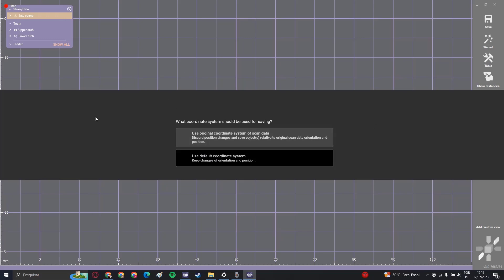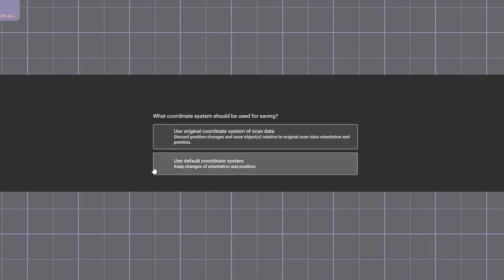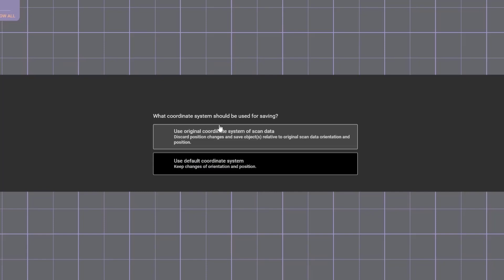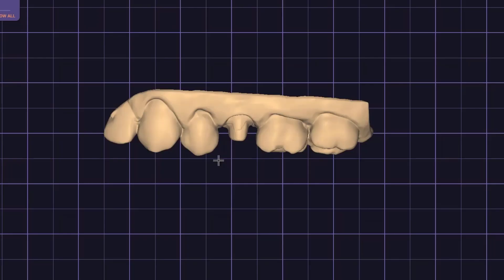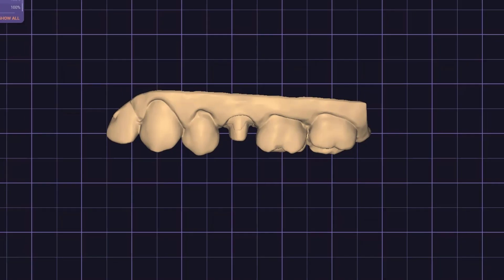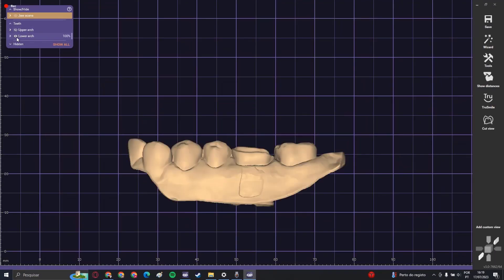Now, this is the important part. You have to click use default coordinate system because it will put the scan in the right position. The original position was wrong, so use default coordination system. Now we're going to do the same with the lower arch.